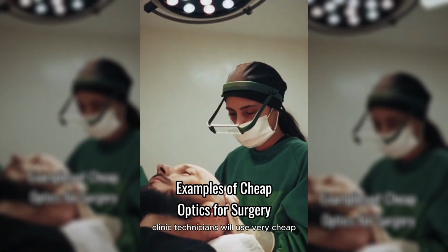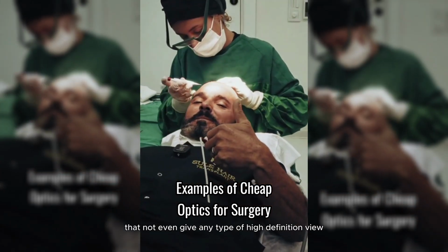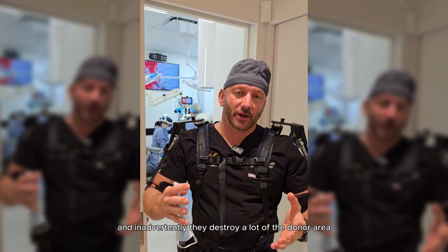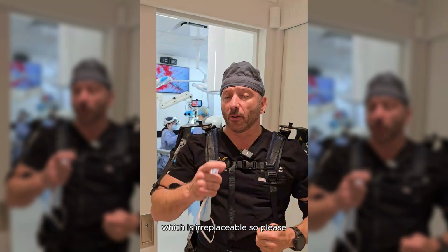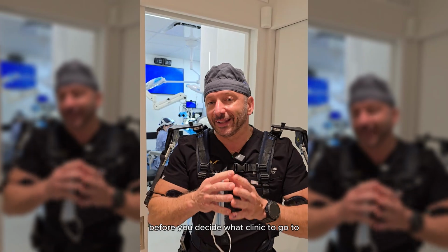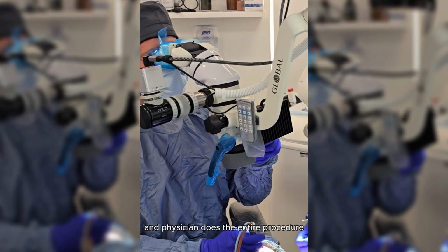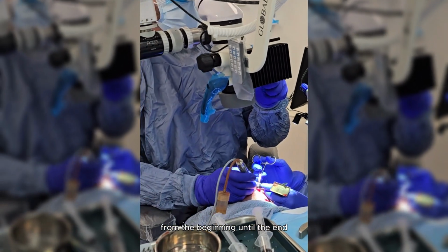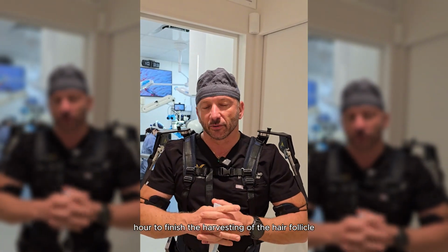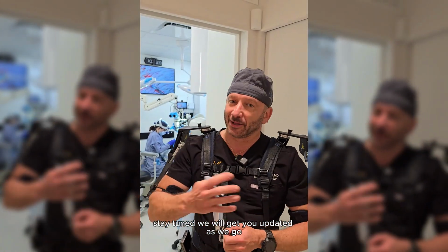A lot of these cheap clinic technicians will use very cheap Amazon style glasses that do not even give any type of high definition view, and inadvertently they destroy a lot of the donor area, which is irreplaceable. So please make sure that you do your research before you decide what clinic to go to. Your best bet is to always make sure it's led by a physician, and the physician does the entire procedure from the beginning until the end. I estimate we have another hour to finish the harvesting of the hair follicles, and we'll continue with implantation using the same approach. Stay tuned, we'll get you updated as we go.